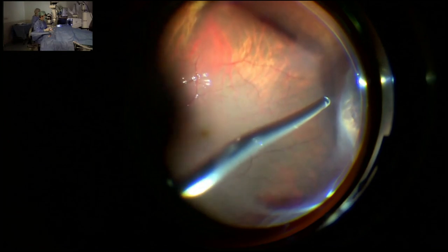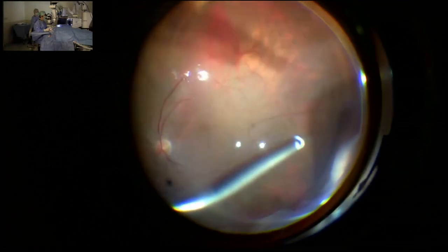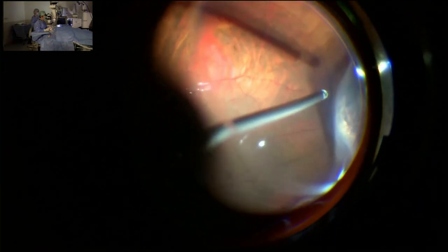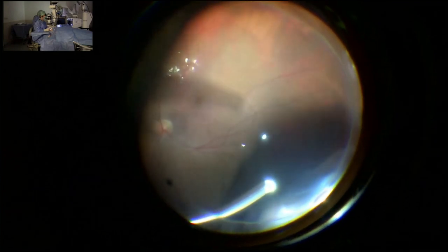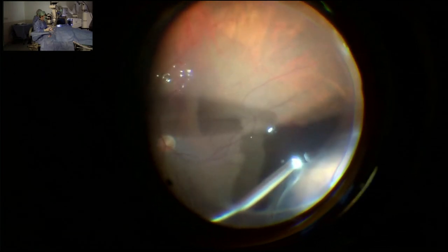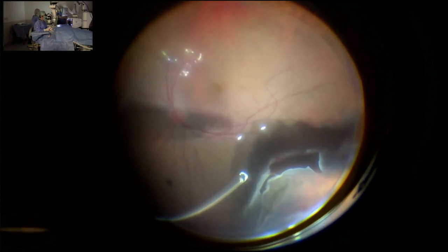Professor, how thoroughly do you clean the periphery? So in the retinal detachment case, I try to clean the vitreous as much as possible to prevent PVR complications. But now we have almost finished the vitreous base cleaning, the inferior and also the superior part, but there is still some vitreous here, and then we will give more perfluorocarbon. But in such a patient, after injection of PFO and attachment of the posterior pole, here there is a retinal bridging, but I will not cut this bridge, but I will do diathermy there.